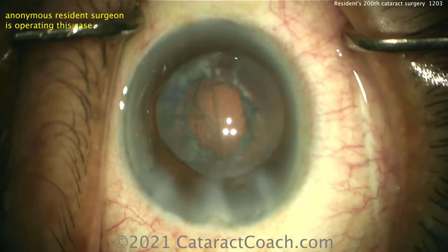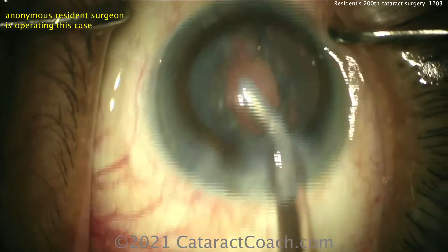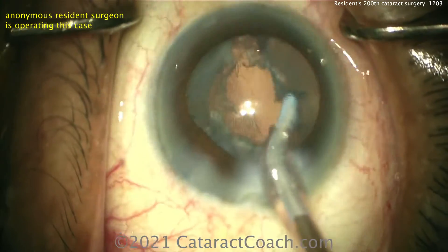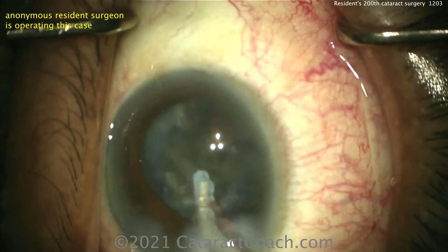For cortical cleanup, looks like a coaxial tip coming in — yep, there you go. Taking out the cortex, so far so good. Now you're going to have a little bit of a tough reach — again it's a smaller rhexis, so it can be a little harder to access. In this case the rhexis ended up probably about four and a half millimeters in diameter.